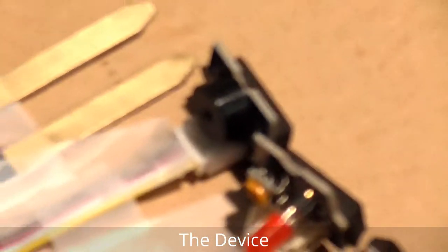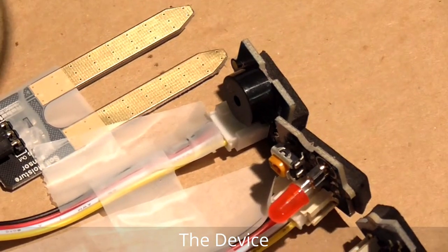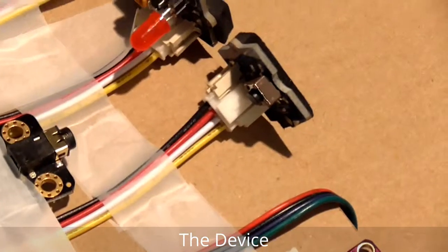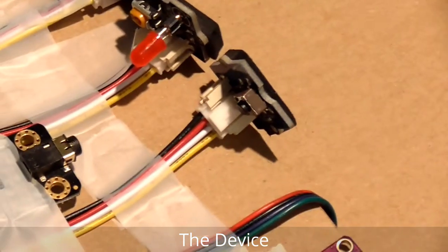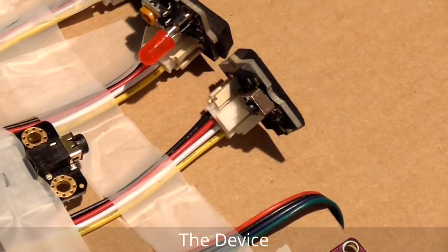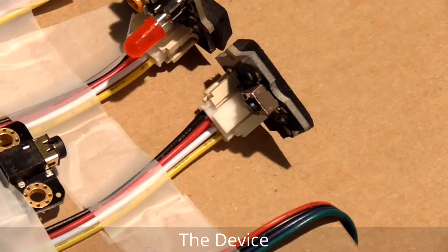The buzzer will also turn on and give an alarm. This is the button so the patient can use it — if the patient does not feel good, he or she can press this button to call the doctor or nurse.